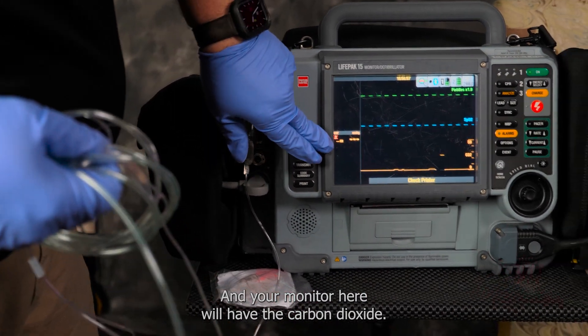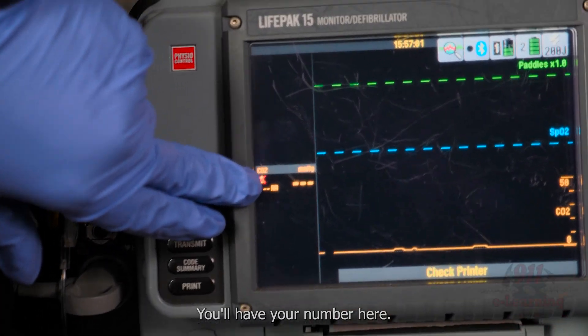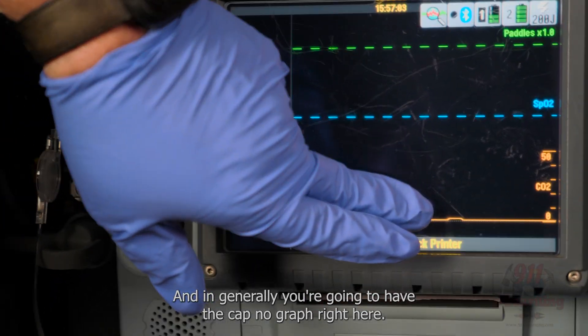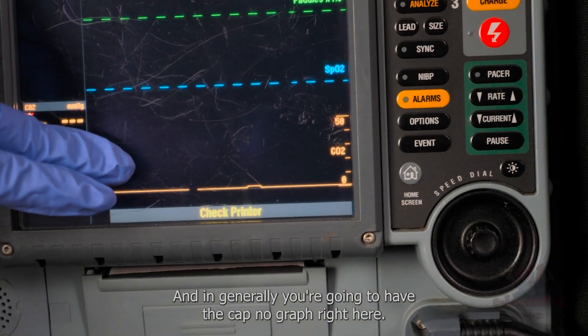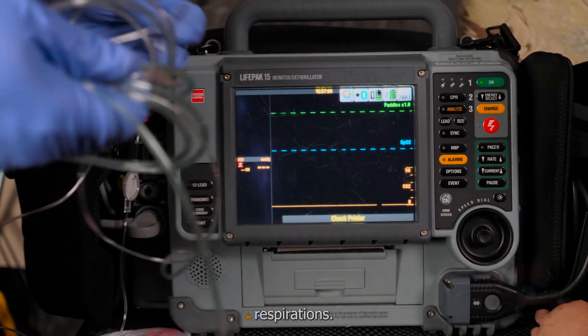Your monitor will display the carbon dioxide number here, and generally you're going to have the capnograph right here that shows you the patient's respirations.